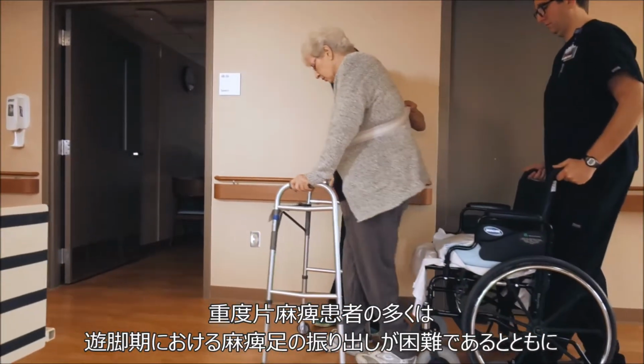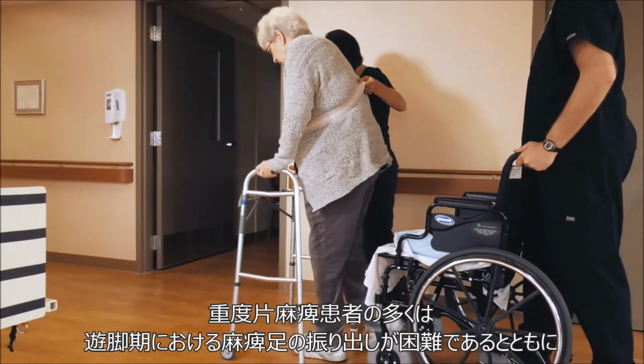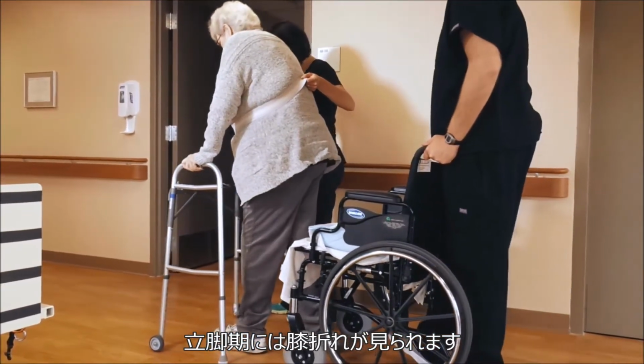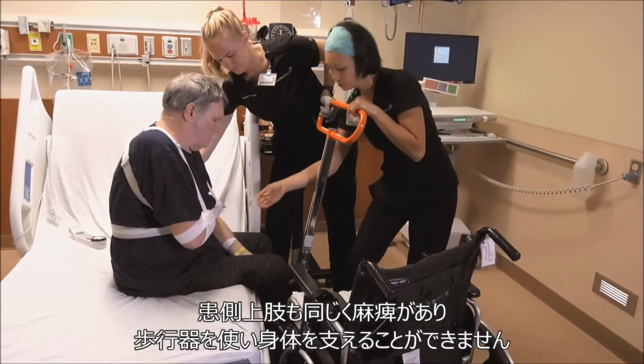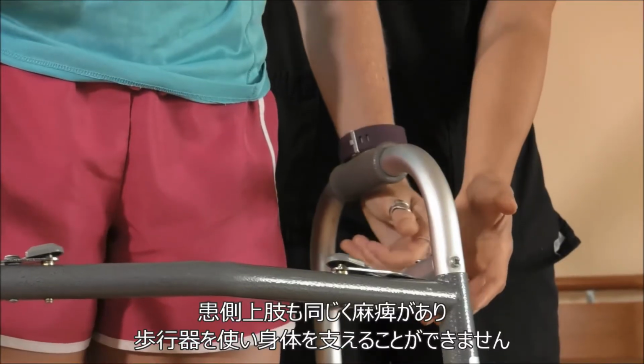Most patients with severe hemiplegia have difficulty moving or advancing the affected limb during swing phase, as well as difficulty bearing weight during stance phase. Because the arm on the weak side is usually affected as well as the leg, patients often lack the grip necessary to use a walker for support.